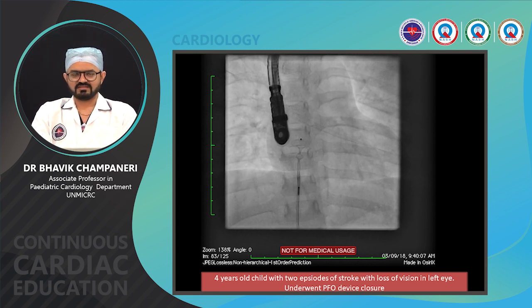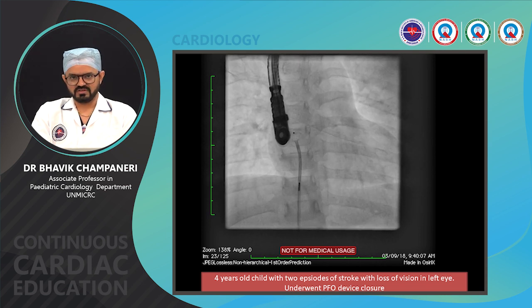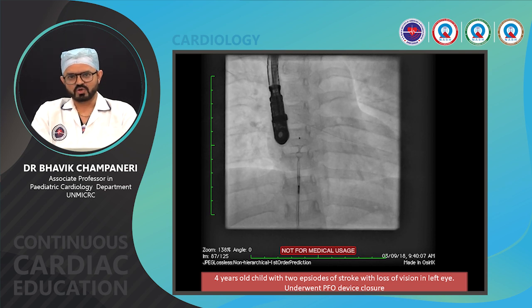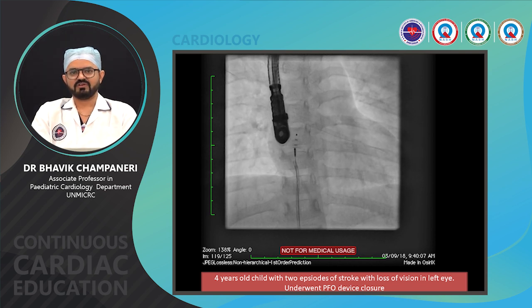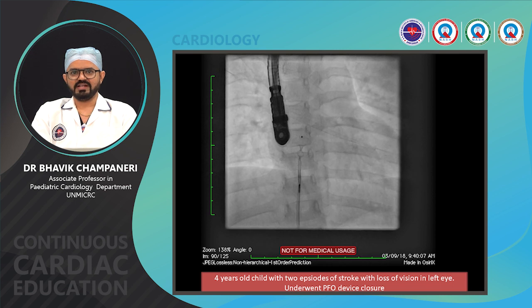So this was, as discussed earlier, an indication for PFO device occlusion, because there was a documented history of 2 strokes with loss of vision in the left eye, and this patient underwent device closure of PFO with an ADO2 device.